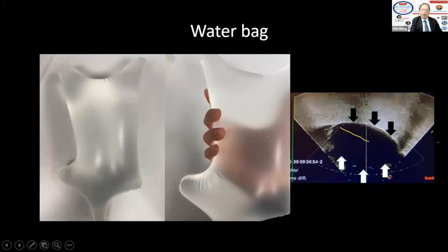However, the so-called focused ultrasound has a fixed focal length. Therefore, for some very obese patients, we need to make sure the focal length can reach the lesion we want to burn, especially posterior large fibroids. But some patients are very thin, and for an anterior fibroid you might need to put a water bag to elevate the patient so that the focus point from the transducer can focus on the fibroid. Knowing how to use the water bag is very important for the nurse, because it saves you a lot of problems.